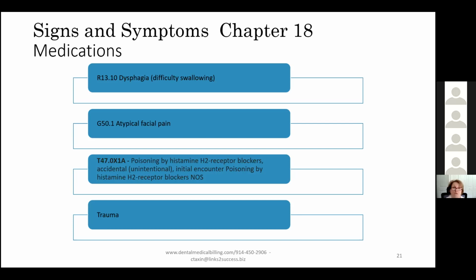And why would you not want a CBCT scan? Because sometimes pathology on X-ray doesn't show trauma, and sometimes it doesn't even show on the CBCT scan. So trauma is unique in keeping that case open. And when you're doing a case, we should be documenting how long this patient should be under our care. Well, the younger they are in a trauma case, the longer they should be in your care. If you're doing implants and bone grafts, how long should they be in your care? Our follow-up is as important as the starting point.